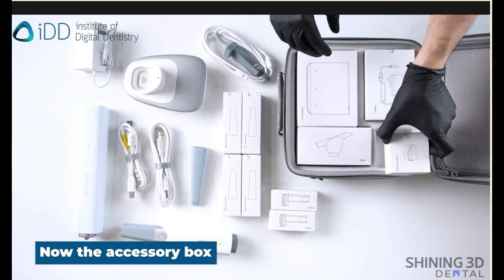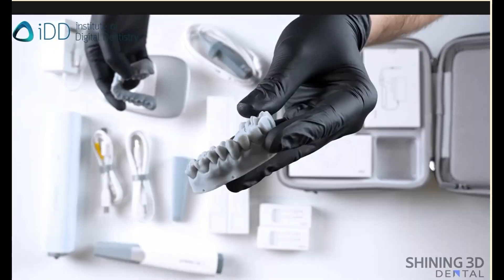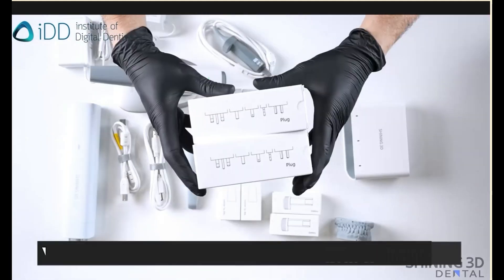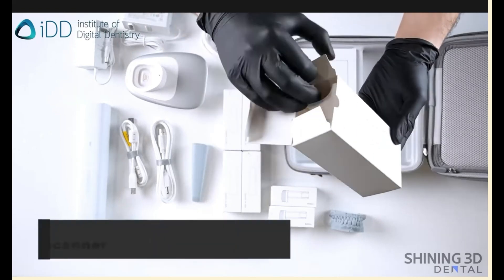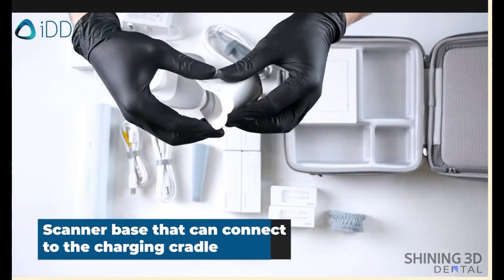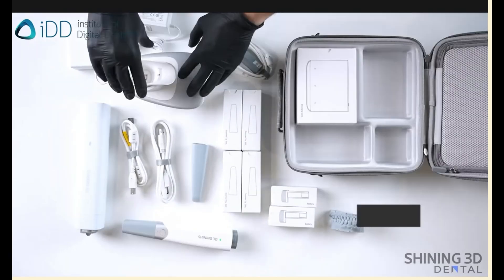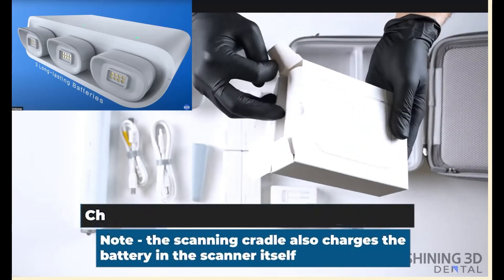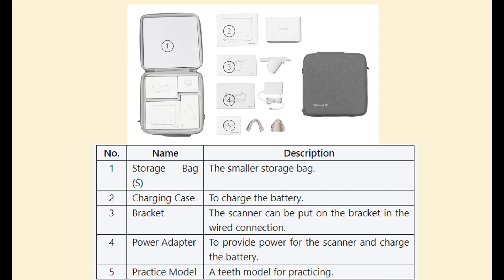Now let's crack open the accessory case. Models are provided for you to practice scanning. There's an additional power supply for the scanner cradle, and the international power supply adapters. A cradle adapter allows the scanner to be seated while not in use clinically; however, in this configuration it does not allow the cradle to be used for charging. Finally, the battery charger allows three batteries to be recharged simultaneously. And this is the accessory inventory list.